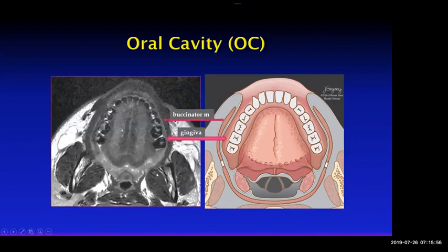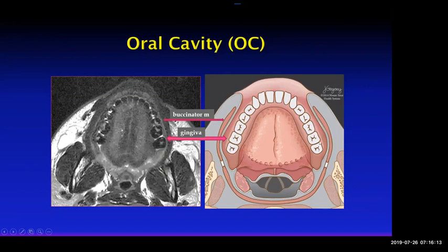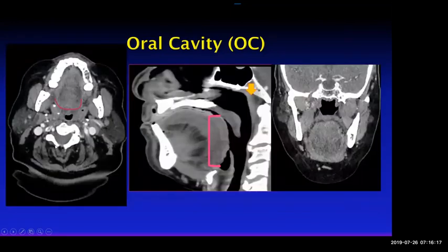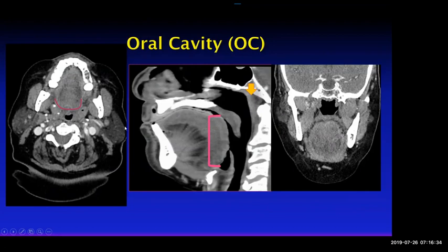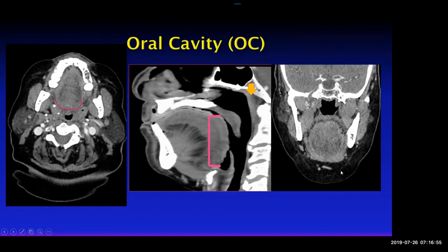The circumvallate papillae divide the tongue into the oral tongue and the base of tongue, which is part of the oropharynx. Inferiorly, the oral cavity is defined by the floor of mouth, formed by the mylohyoid muscle. The anterior margin is your lips, and laterally it's the buccal mucosa. On this MRI you can see the buccinator muscle and the mucosa lining the vestibule, and also the gingiva or gum.